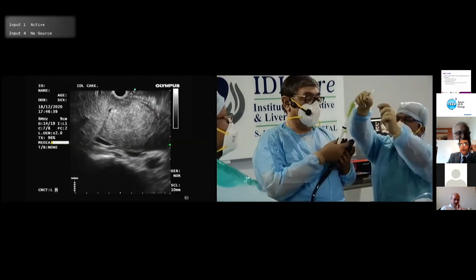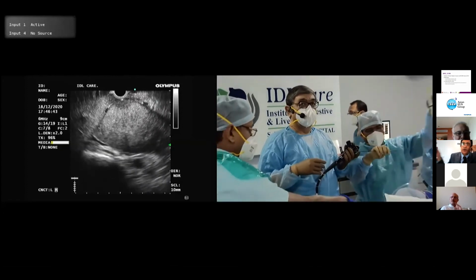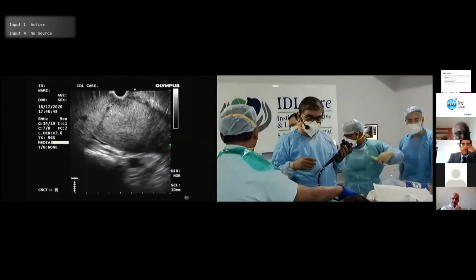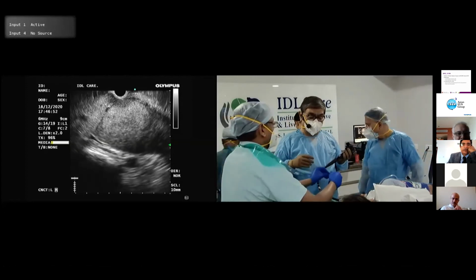Let us see what tissue we can get. What is the number of strokes you would say, sir? How many strokes you would say? It is subjective. It is really subjective. 95% of my cases I make only one pass. This is what I call one pass.